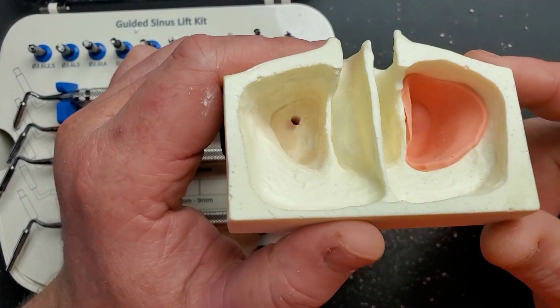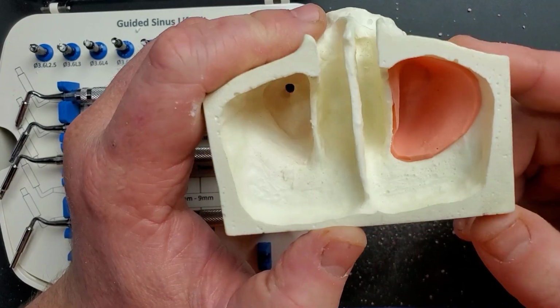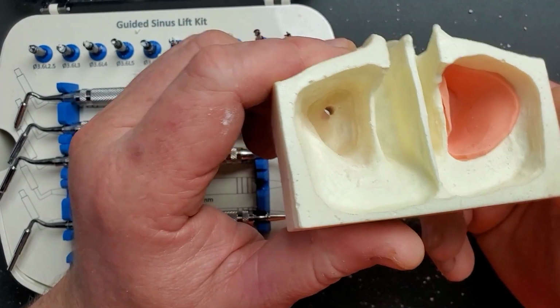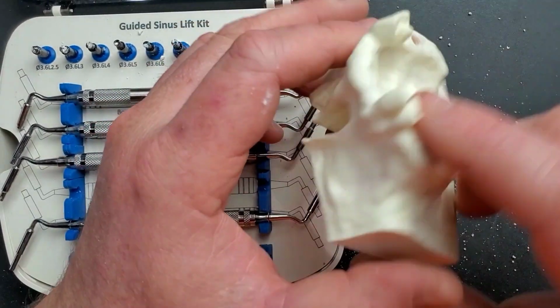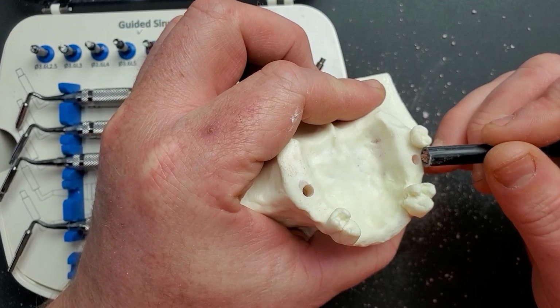Okay, so we're getting that nice dome of bone, exactly what we're wanting. And if I was doing this clinically, I would just make the determination if I've got enough height yet. I'm going to do just a couple more loads and then we'll go ahead and place the implant.